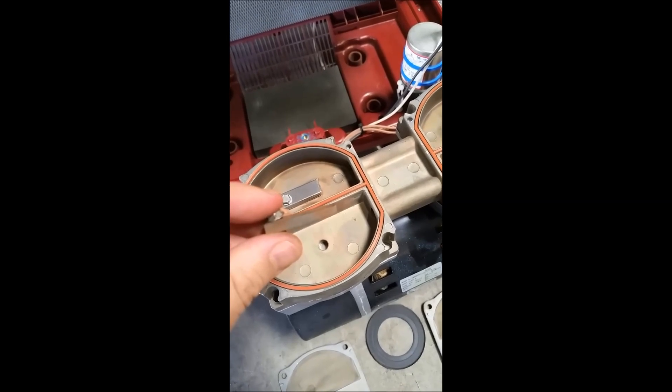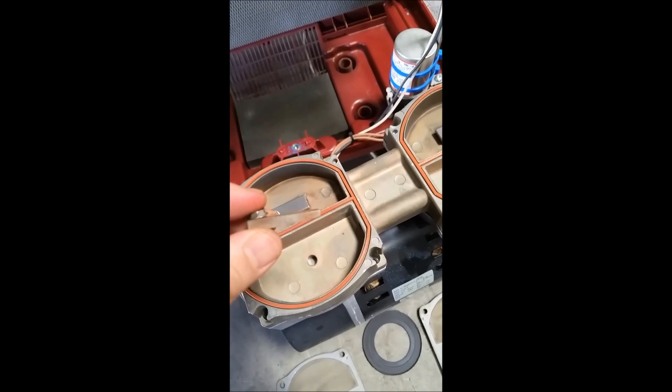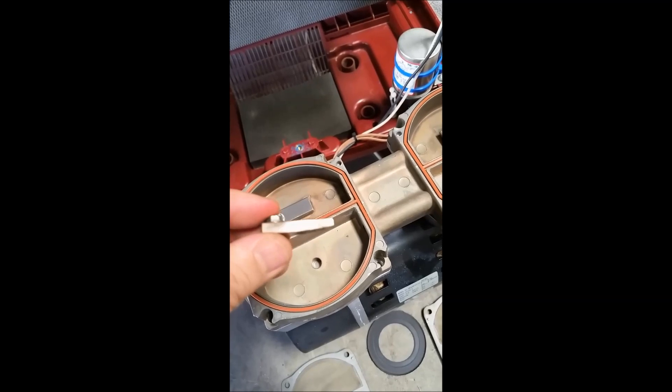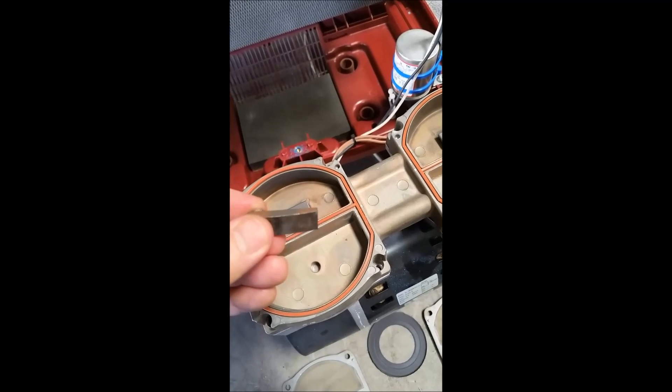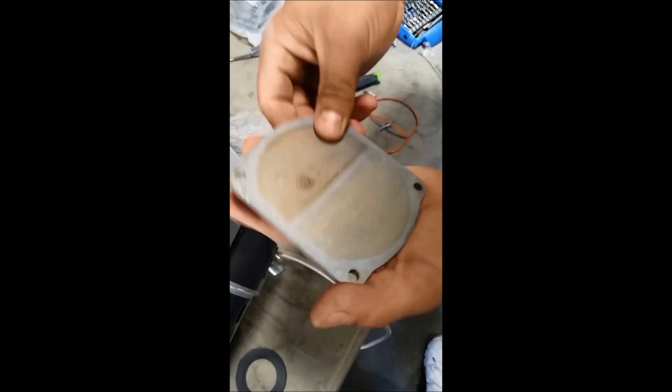One final thing when placing these in: you'll see that this piece is sloped. The sloped side always goes down, not the straight side — so sloped side down, straight side up. Now we'll clean these as we talked about earlier, making sure that they're free of any dust and particulates.